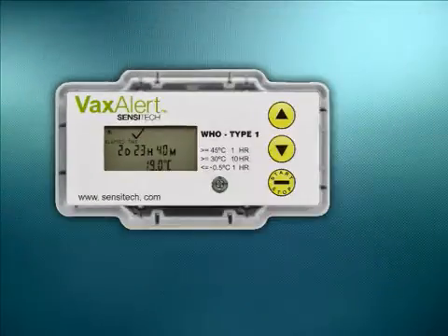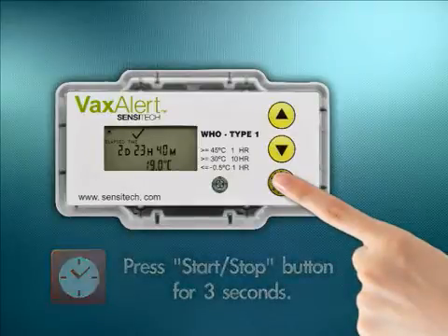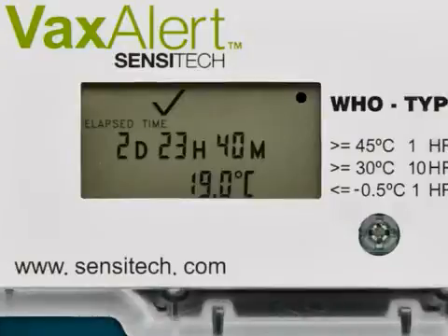In order to stop the Vaxalert, you must press the Start/Stop button for 3 seconds. The Vaxalert will emit an audible tone, and the run sign will disappear from the top left corner of the screen. In addition, the stop sign at the top right corner will be displayed. The device is now stopped and will no longer monitor temperature.